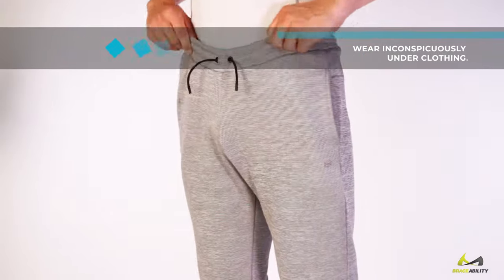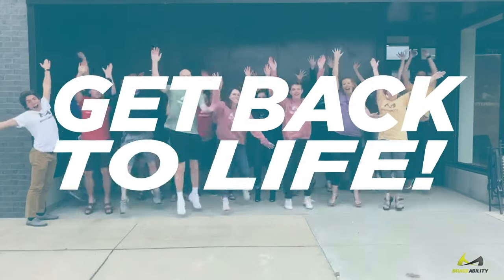Wear inconspicuously under clothing. Braceability — we're on a mission to help you get back to life.